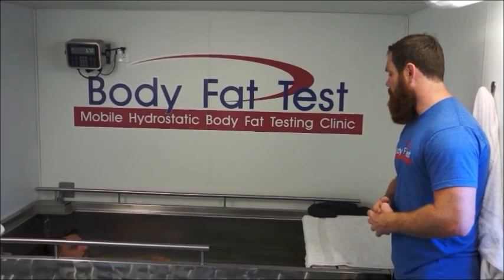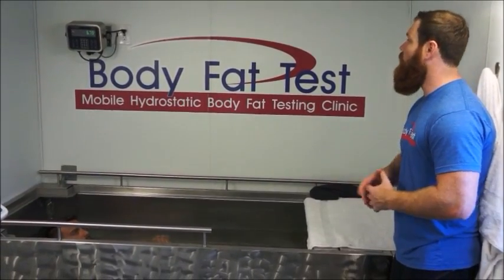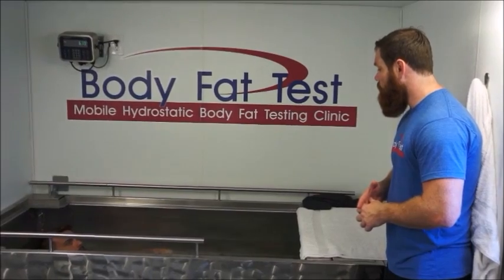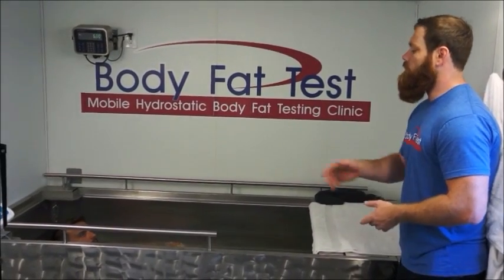There's our controlled variable — the air. We need to completely eliminate it. It's like blowing out all the factors. In fact, the more air we get out, the more accurate the test. It lets your body settle to the center.